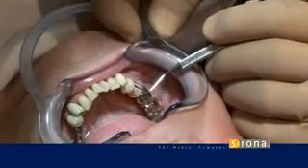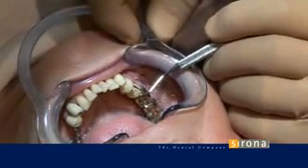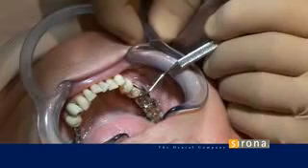Before beginning treatment, we will now once again check the probe depths in order to get an overview of the current situation. Tooth 4-5 is being probed. The pocket depth here is just under 7 mm or 6 mm, for example.